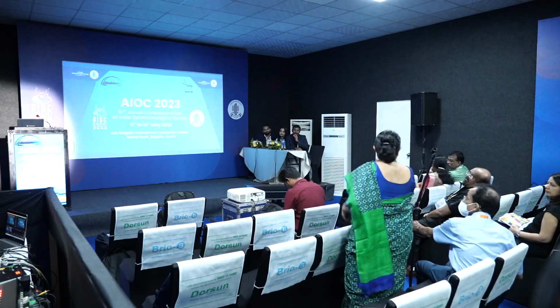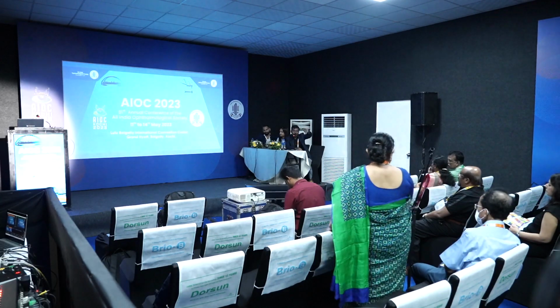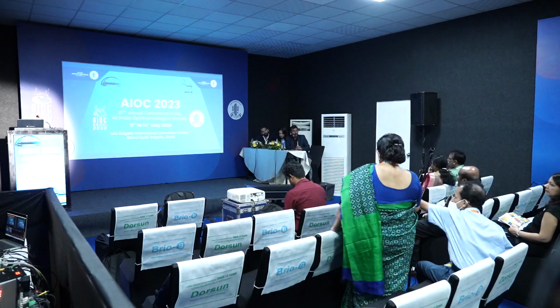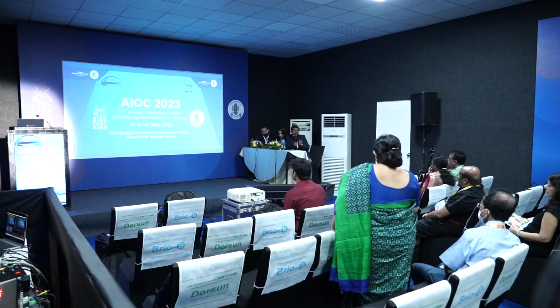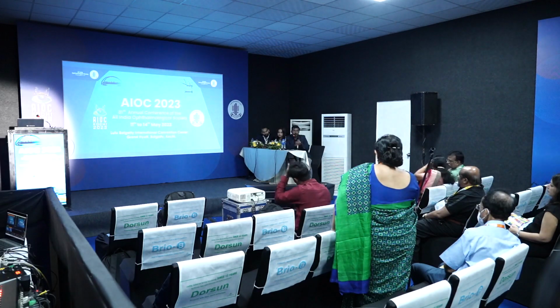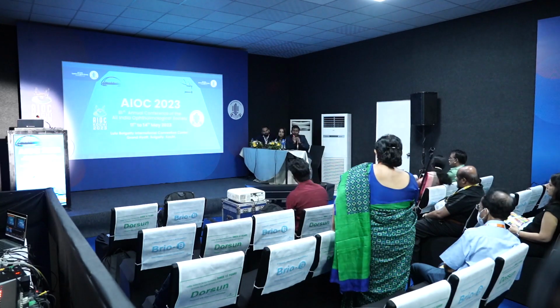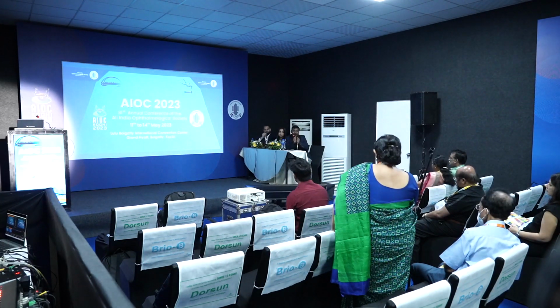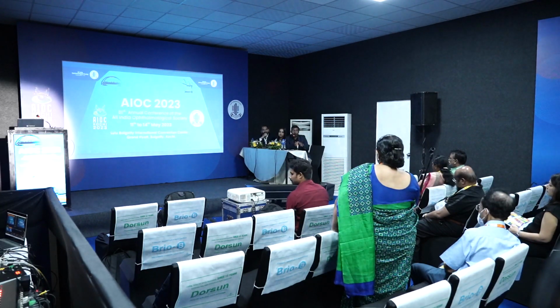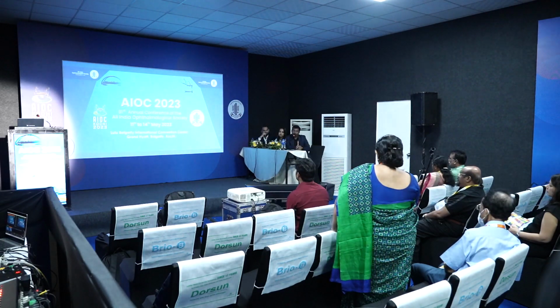That's the same thing as Binox. Yes. So Binox and some other companies also here in the stall, they have paid subscriptions for their training. They use the same principle. They use the red-blue glasses and they give amblyopia therapy using that. You have the free versions also available. You have Tetris, you have all these small games, Mobile Snake also available for free right now. So you can try your patients on that first before going on to the paid things.